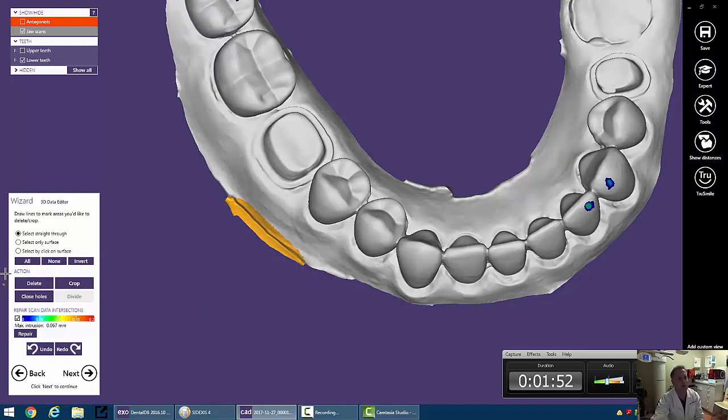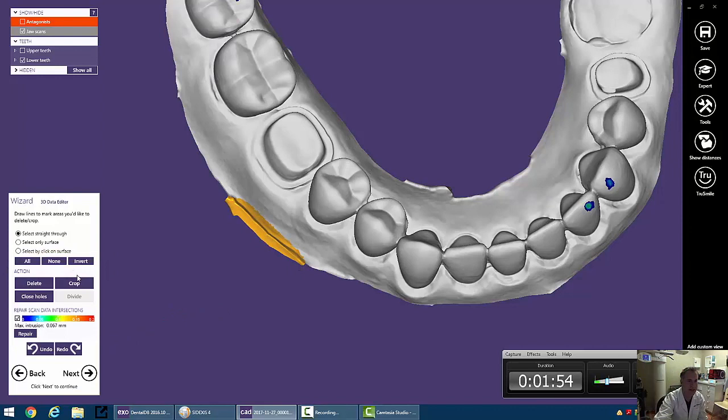Then we have sort of different ways that we can interact with this. So we can go ahead and go into Delete, and that's just going to go ahead and cut it out.